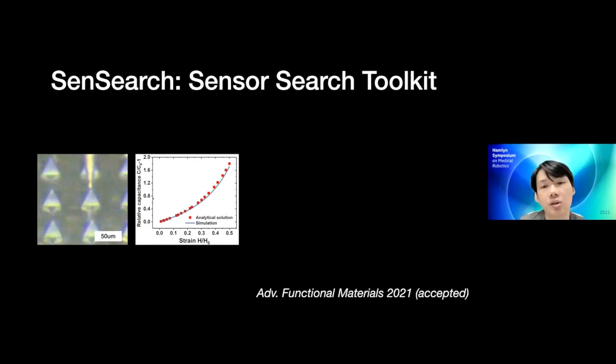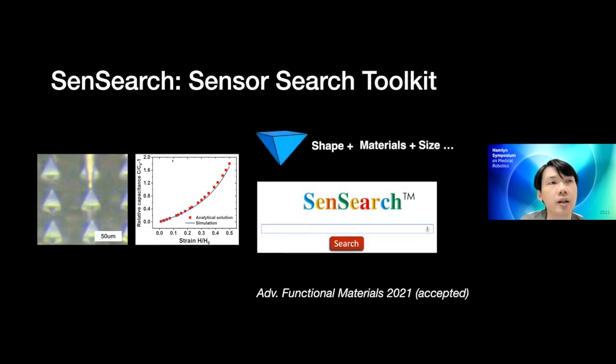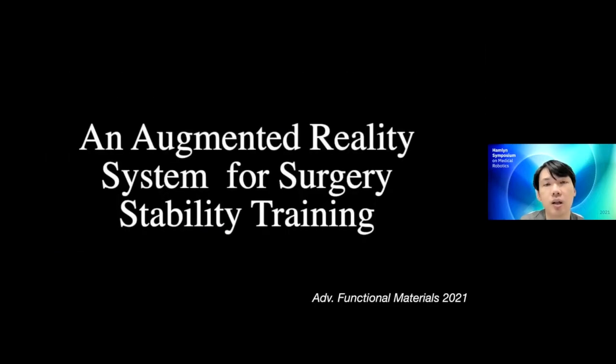So capacitance is a way to measure the mechanical properties of such structures, and it gives you an indication of how much force you're applying. And so, having such models that well matched with experiments can allow us to build such engines that allow designers to design sensors that they need of any sensitivity or working range that they want. And so using such systems, we can design sensors that can respond to soft and stiff tissues, right?